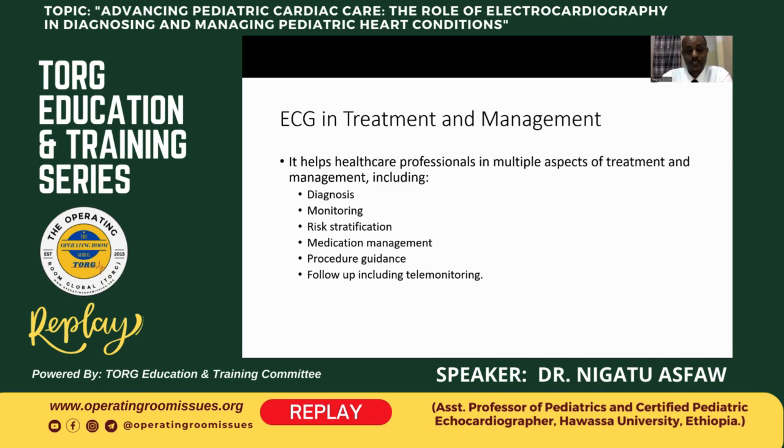So we can use ECG for monitoring, and it may also guide us in procedures like heart catheterization, and it can help us in telemonitoring, so we can monitor the rhythm of a patient by recorded Holter monitoring.